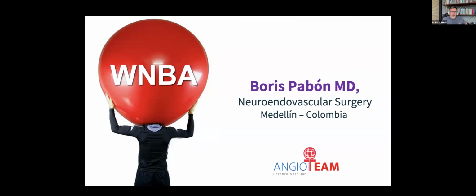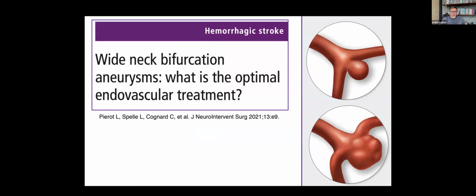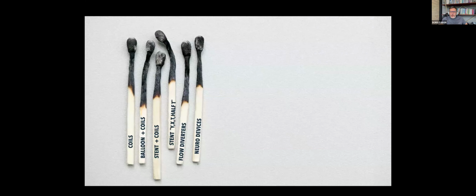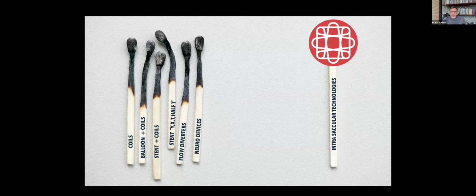Today I will talk about wide neck bifurcation aneurysms. Probably everyone in the attendees has the same question: what is the optimal treatment for this condition? And the best answer, unfortunately, is that nobody knows what the optimal and best treatment is. Over the past 2 decades, a variety of tools and different approaches have been used, and more recently the intrasaccular approaches have triggered our interest in the field.